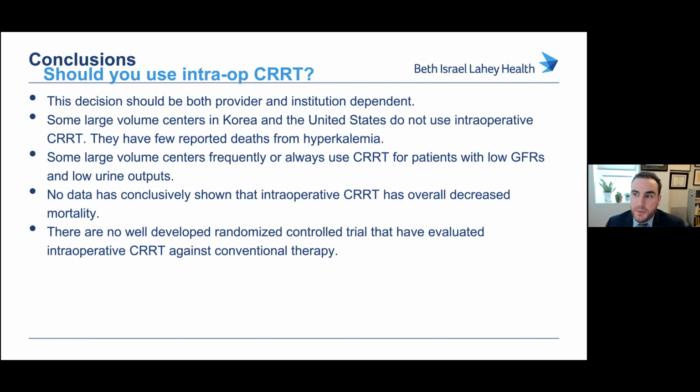We've never had to do this, but we could also use intra-abdominal warm saline to try to warm the patient up, because we have a lot of that available to us. But a few times when we've been using our intraoperative renal replacement therapy, we turn it off. We say, thank you, we've used it as much as we can. The patient's too cold, we need to warm them back up, and we just stop using it.